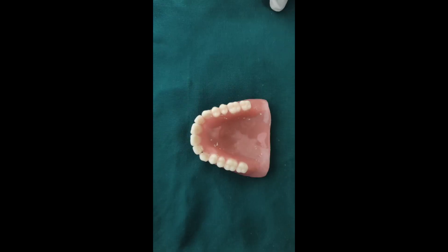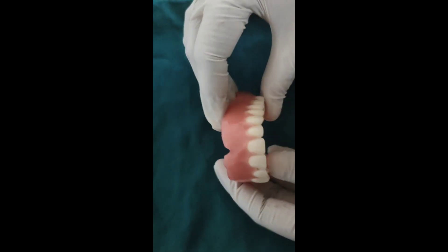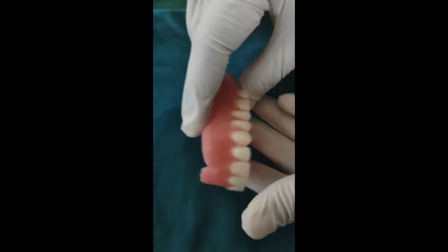In this segment we are going to see about evaluation of the complete denture. Evaluation of both the maxillary and the mandibular complete denture is necessary before insertion of the complete denture into the patient's mouth.